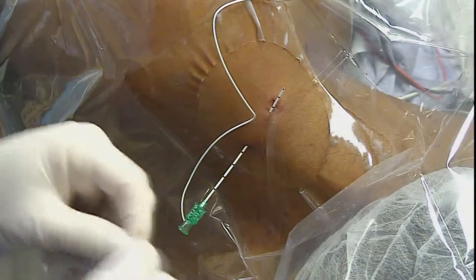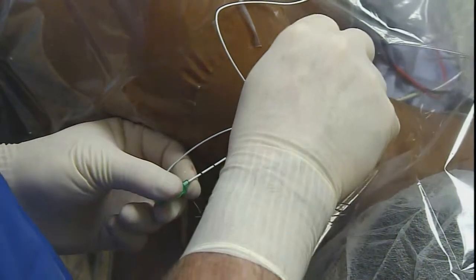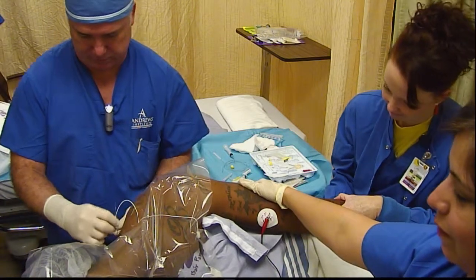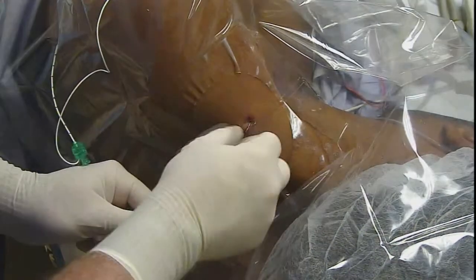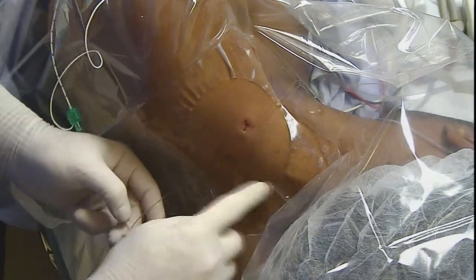When you get to my age this is the hardest part of the whole thing. Dr. Winchester is younger and can see better, but trying to get this catheter in that Tuohy needle sometimes is kind of tough — we got it in pretty easily on this one though. We'll slide it right through here and slide our needle back. Now we've tunneled our catheter so that it's actually coming out closer to the C-spine and out of the surgical field's way.